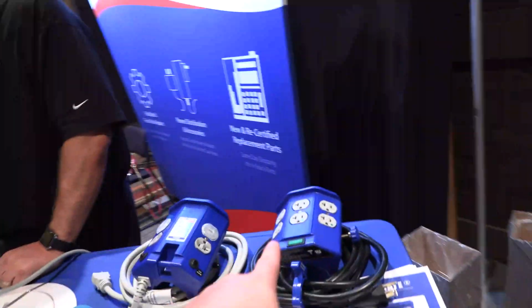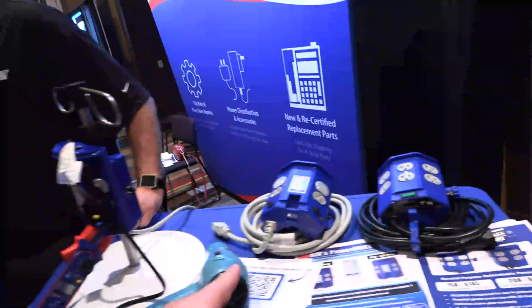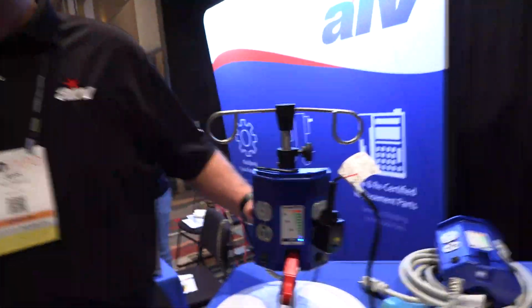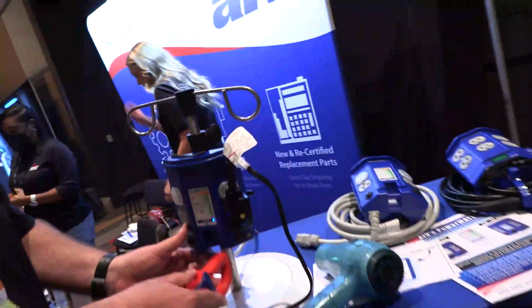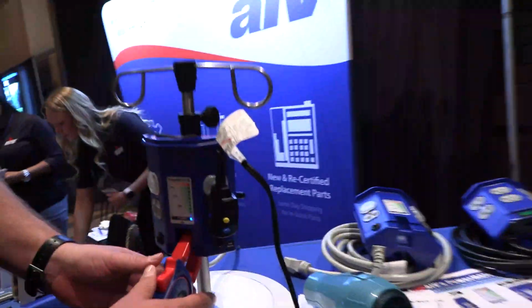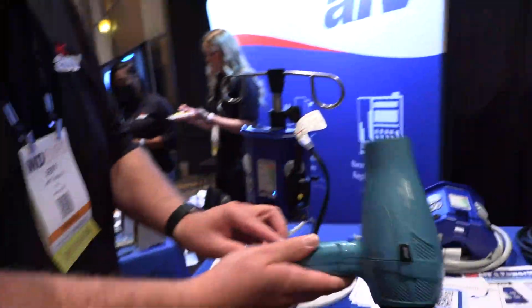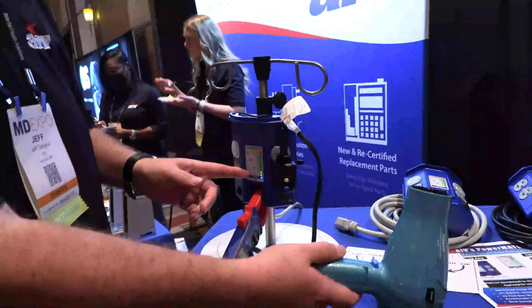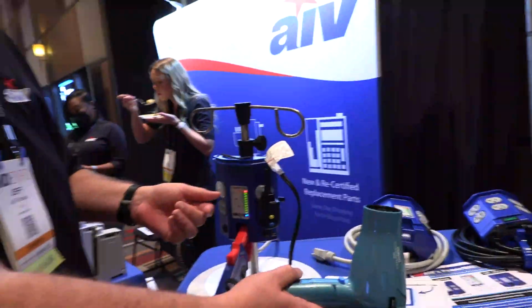And look at these. That's interesting. This is the one that we have used for years, and these ones are new. This is the PowerMate CM. So this is actually showing current draw. This is just a tester, so if you wanted to do a PM on it, you can test and confirm the current that's coming out of it is matching. The nice thing about this is that it shows your current draw for anything that's plugged into it. And if you get above 75% capacity, it red lights.